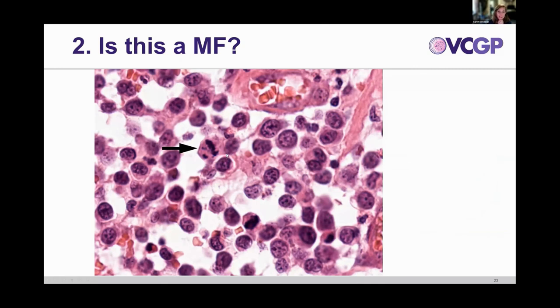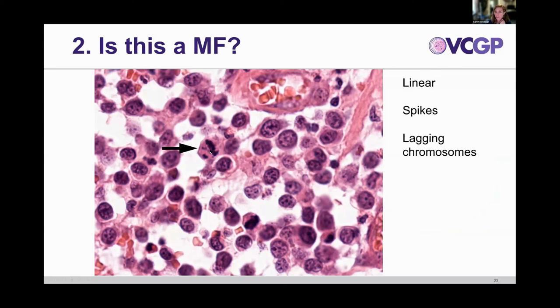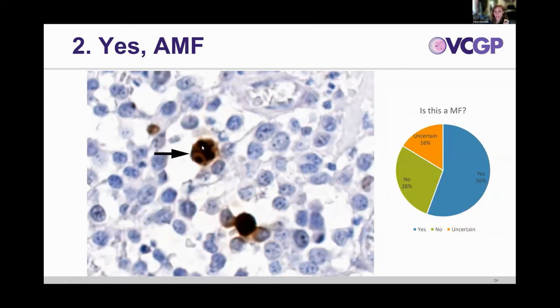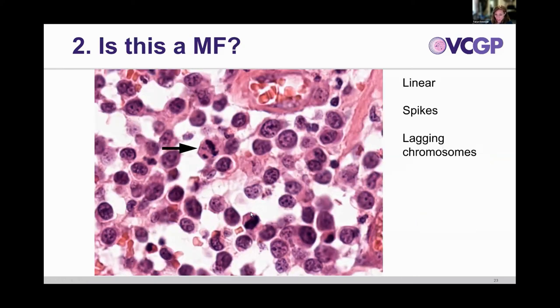The second structure is also a mitotic figure, but there was a little less consensus on this one. It has similar features: it's linear, band-like, spiky, and has chromosomal structures not attached to the band — this looks like lagging chromosomes, an atypical mitotic figure. It stains very nicely on PHH3. It is yes, a mitotic figure — an atypical one — but it would still count towards your mitotic count. There is also another cell staining positively, which is also band-like, very hyperchromatic, with spikiness and irregularity.